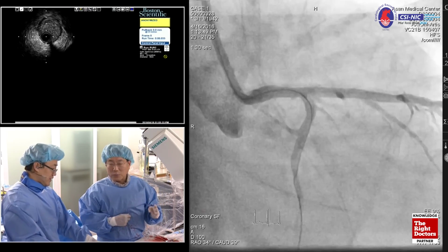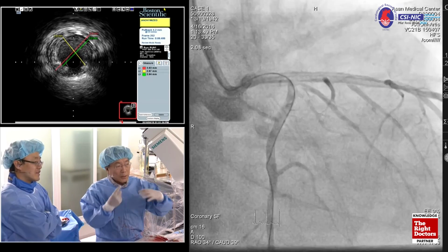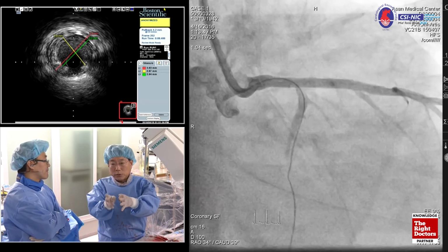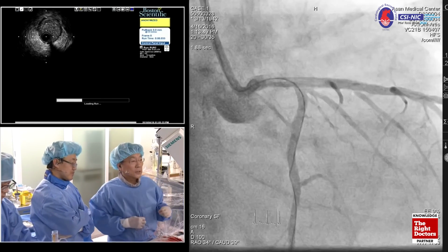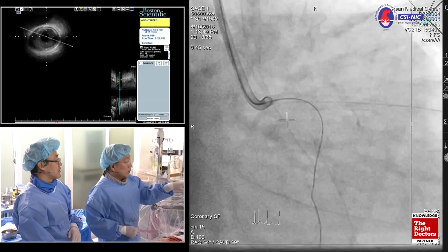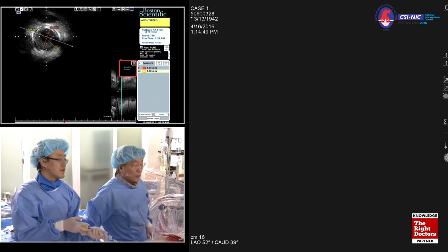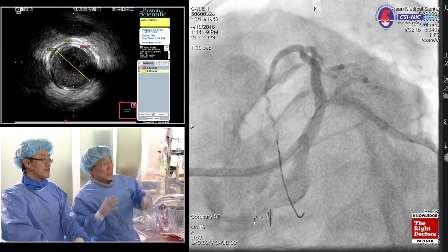What I planned is that we're going to get a good clinical angiographic outcome using the cutting balloon and non-compliant high pressure inflation, which addresses under-expansion of the stent itself, and there's a bigger stent area, right? Would you show us a spider view, please? Okay, got it. We're going to treat the circumflex ostial part as the next step. Okay, good. Take a picture here. All right, I like it. In terms of the LAD side, it's okay.